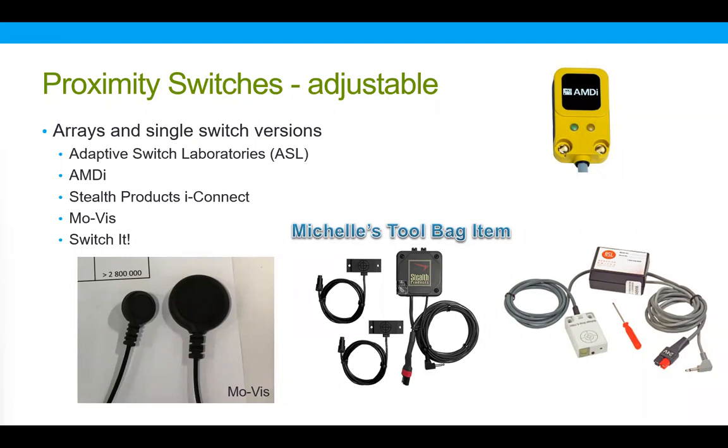These all have a great deal of adjustability in terms of range, often from I'm just about on top of the switch to maybe up to a foot away. The further away you are from the switch, sometimes it can act a little fussy. So it's something to keep in mind. Generally, you're going to have someone fairly close to these switches.